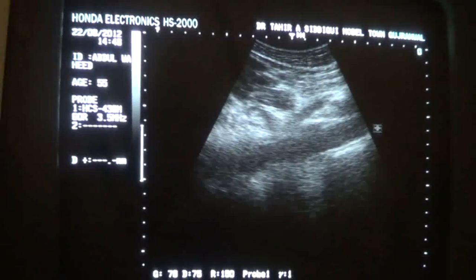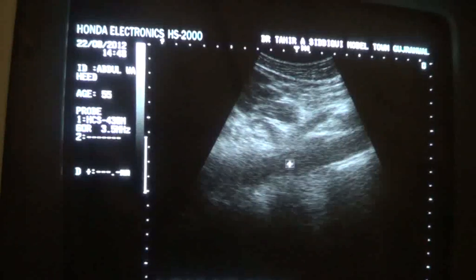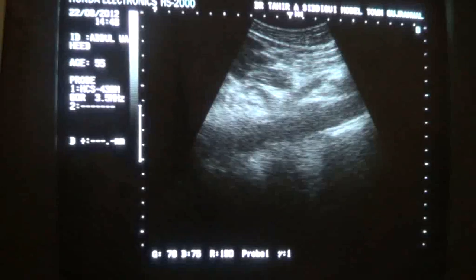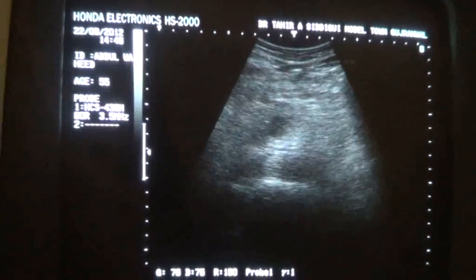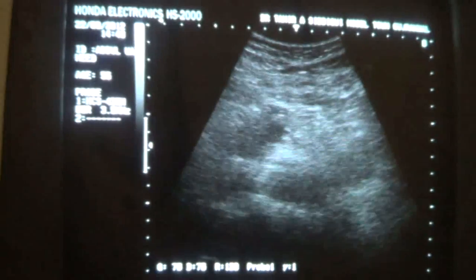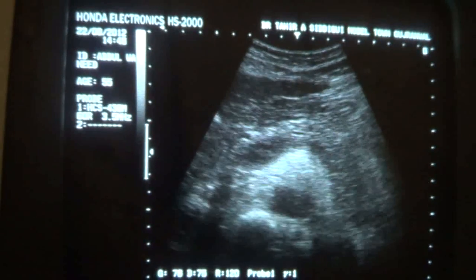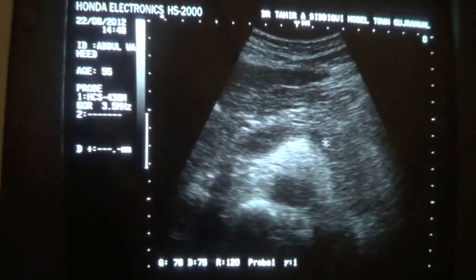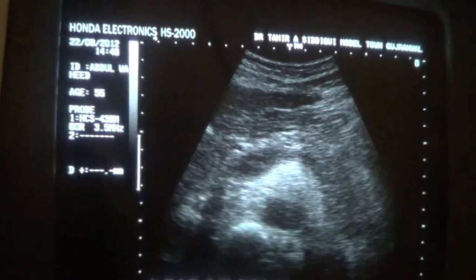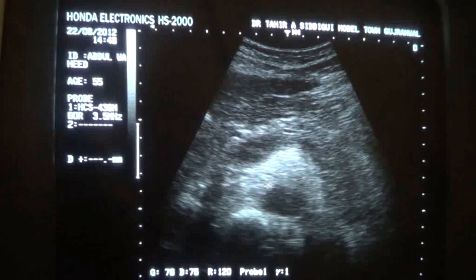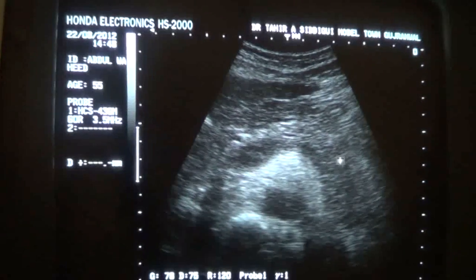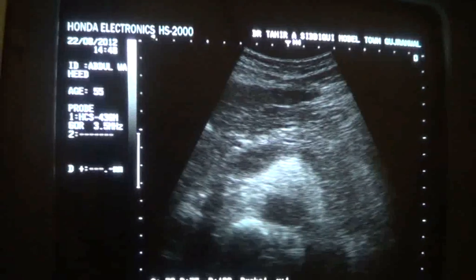This is the aorta. This is the superior mesenteric artery. This is the celiac axis arising from it. Now this is the pancreas. The landmark of the pancreas, as we know, is the splenic vein. This is the splenic vein. This is the pancreas. This is the pancreatic duct. This is the aorta and superior mesenteric vein. This is the tail of the pancreas and the body of the pancreas.